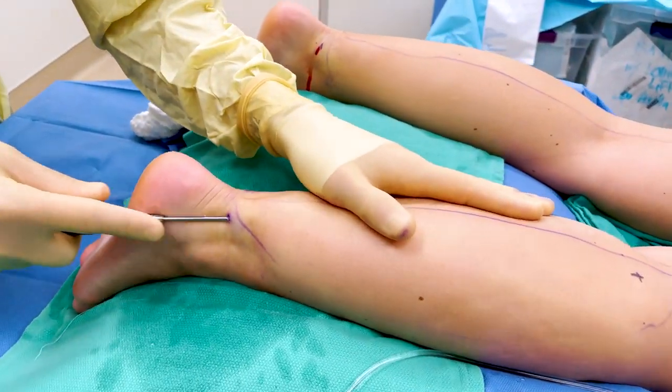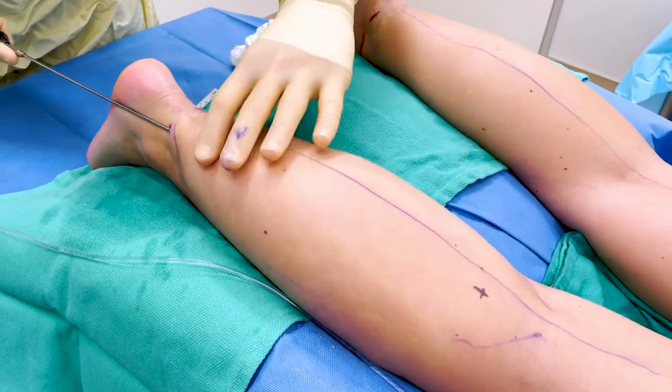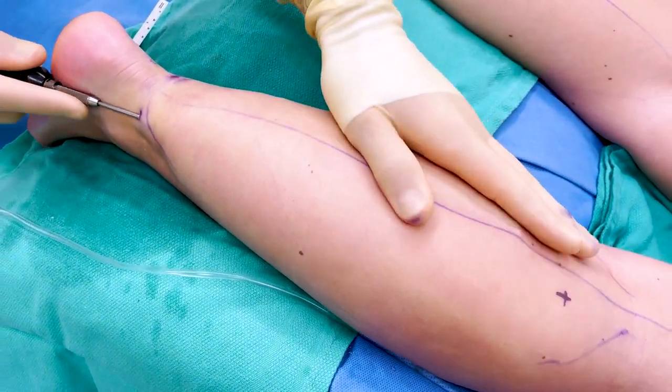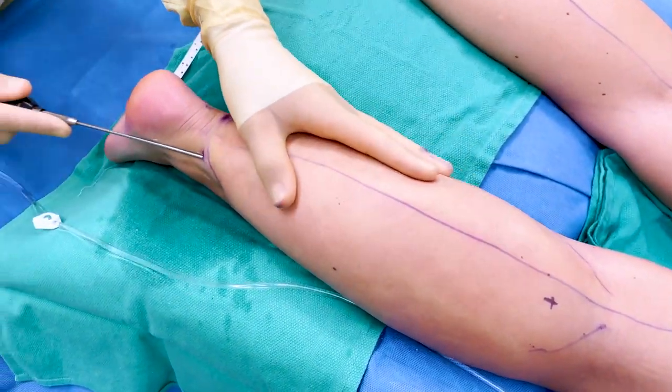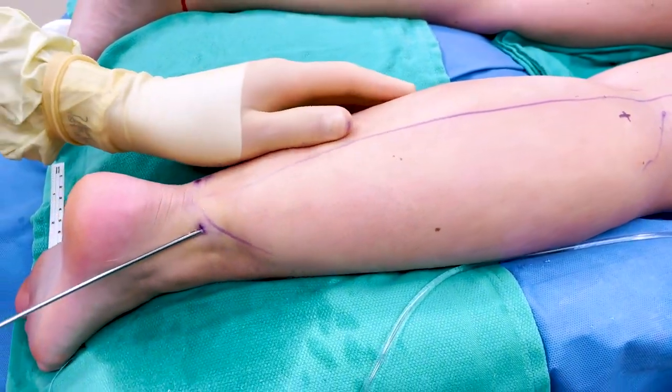We're injecting tumescent solution, and this is really important because, one, we want to numb the area. It has lidocaine solution in there, and it also has epinephrine, and epinephrine is what prevents bleeding inside the fat area once we do liposuction. You get a lot of bleeding if you don't have that.